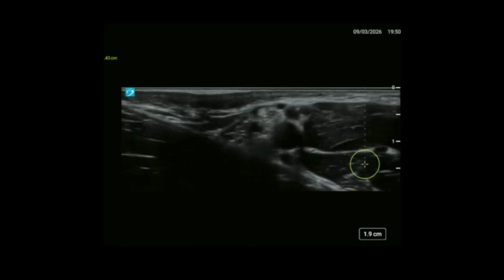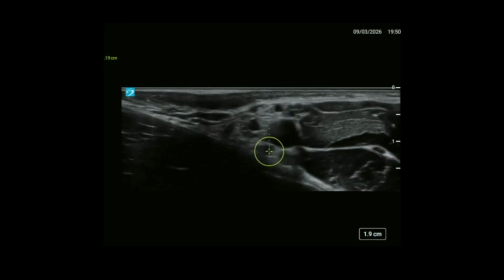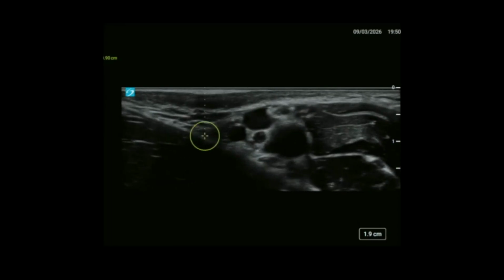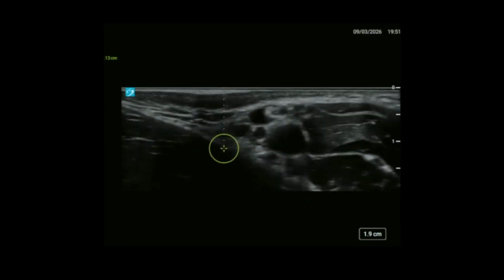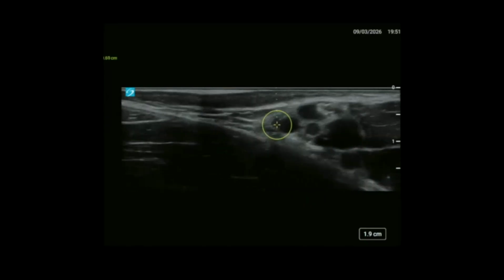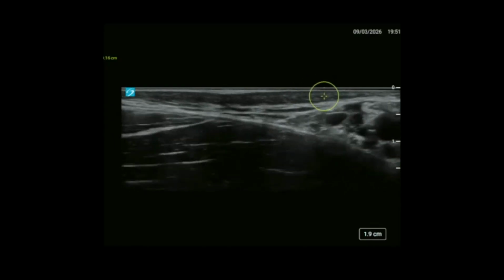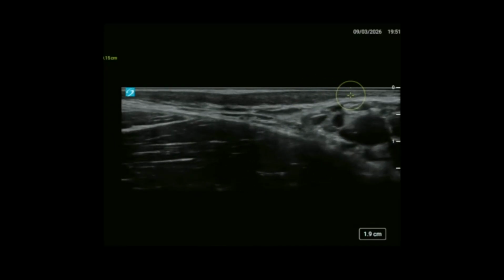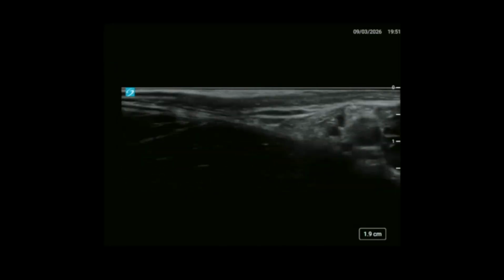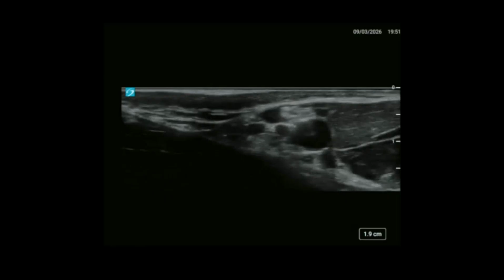Or we might come underneath the artery, getting up here, and then flattening out and getting our needle up here. With the angle of this, it looks like that would be quite difficult. And sometimes, even if it's all really impossible, we can just do a separate skin puncture just over here and bring our needle in down onto this zone. Okay. So all of those nerves potentially need to be blocked.